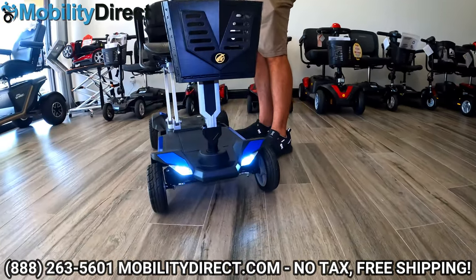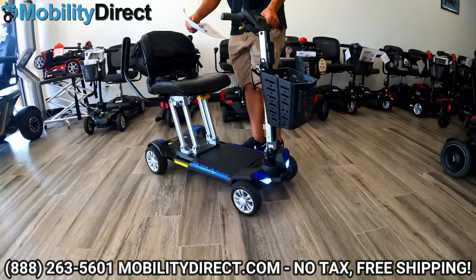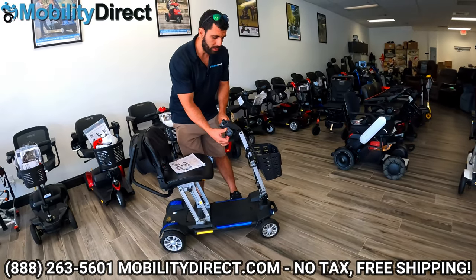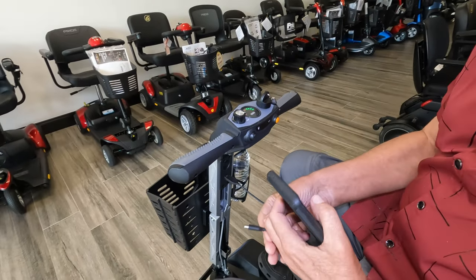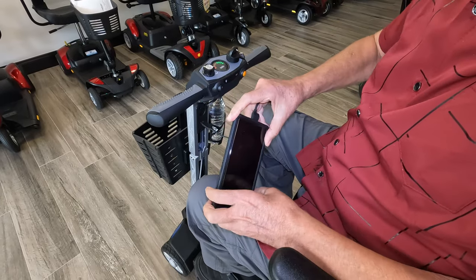The lights will illuminate the path in front of you at nighttime pretty well. The same lever you use to fold the handlebar down can also tilt-adjust the handlebar to bring it closer to you or further away. It also has a USB charging port and a cup holder built into the steering column, so you have those options.